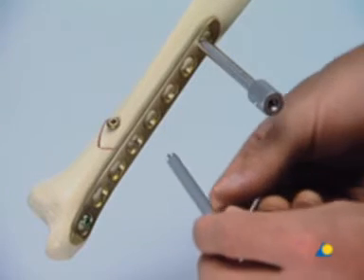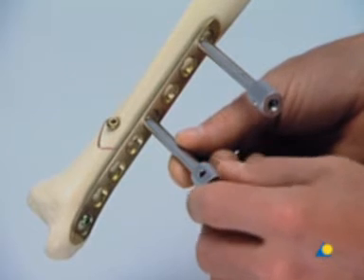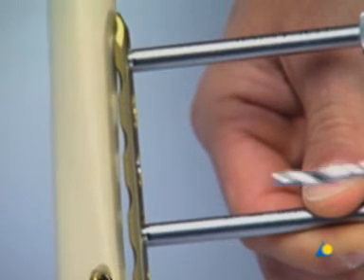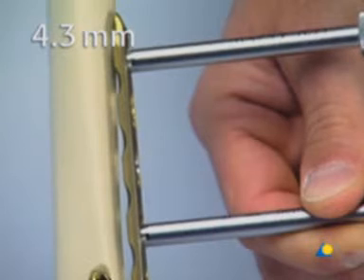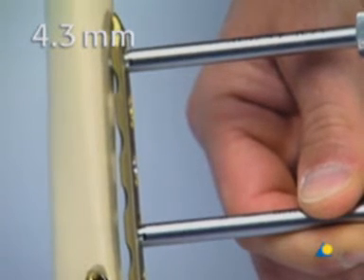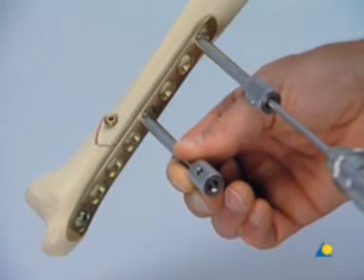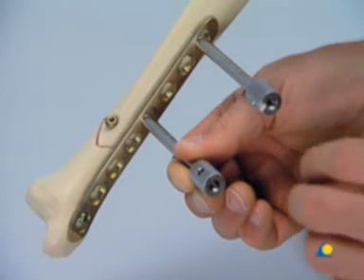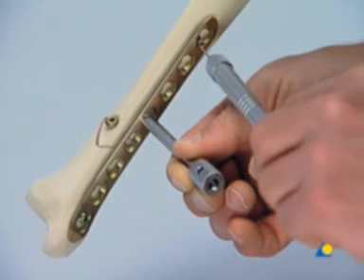The second sleeve is fixed into the fourth hole from the top. Holding the plate firmly with the sleeve, a 4.3 millimeter hole is drilled bicortically through the most proximal plate hole. The drill sleeve is removed and the screw length is measured with the depth gauge.